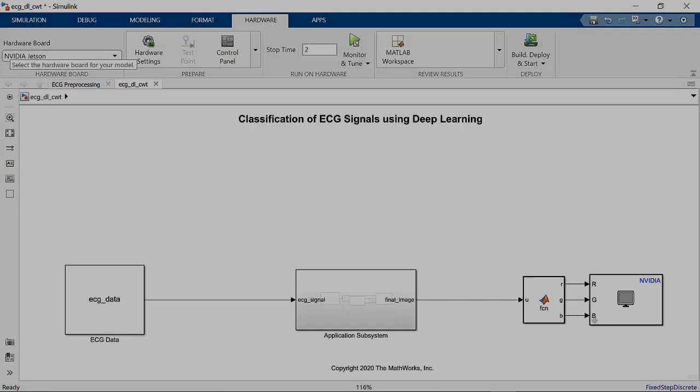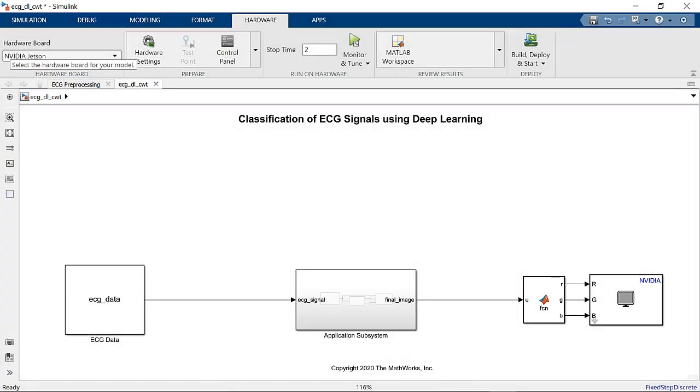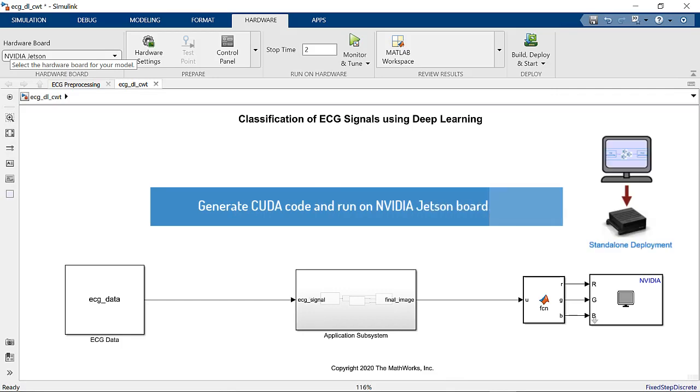Now that we have verified the generated code on the host and target, we can now retarget the complete application to NVIDIA Jetson board for standalone execution.